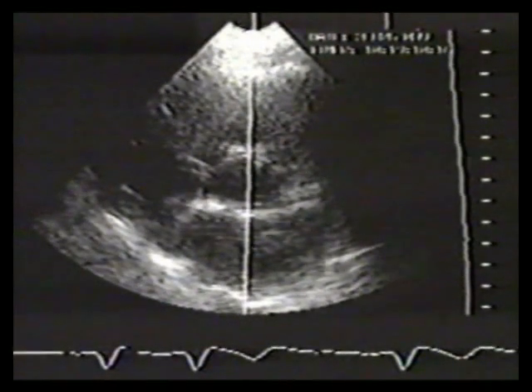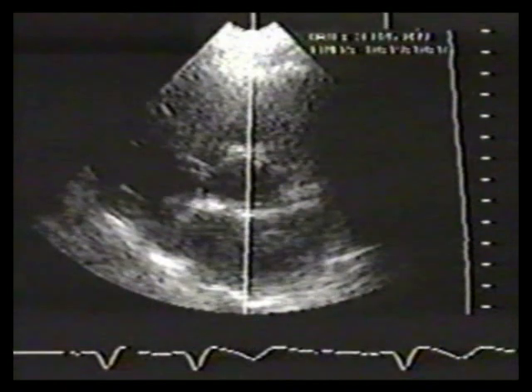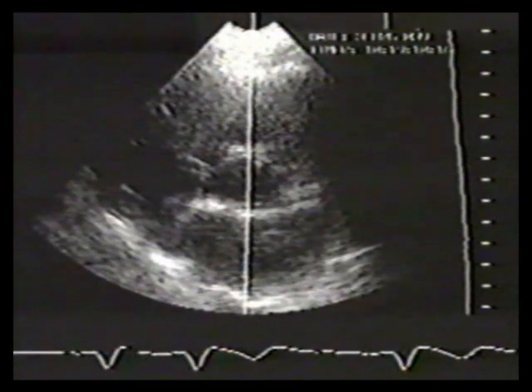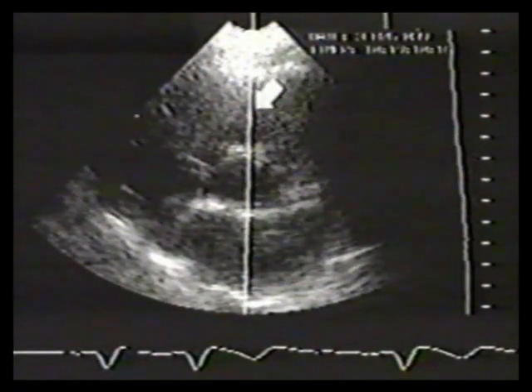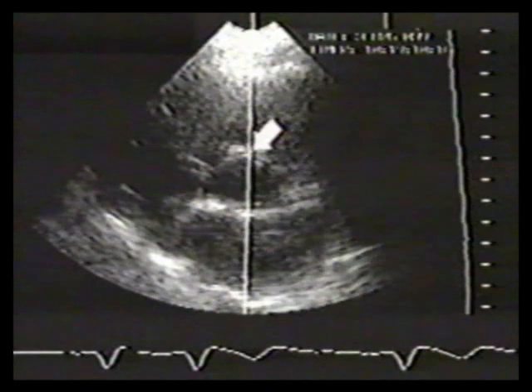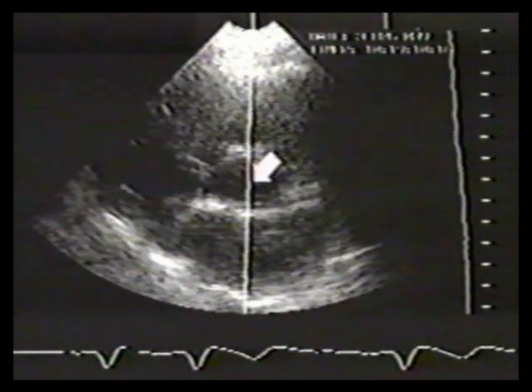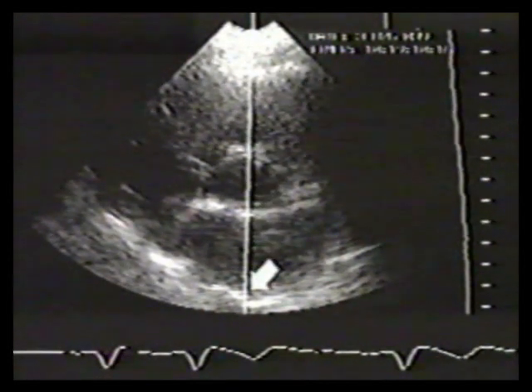It is also useful to measure the left atrium for serial follow-up. Here the cursor has been directed across the right ventricular outflow tract, aorta, and left atrium. The left atrium is mildly enlarged, measuring 45 millimeters.